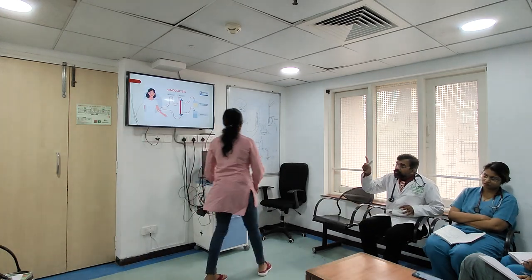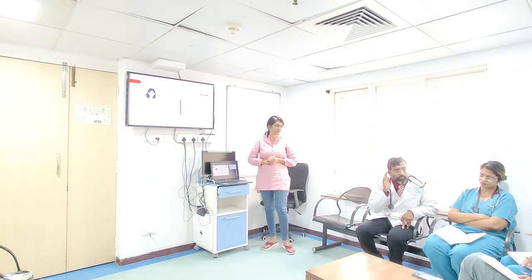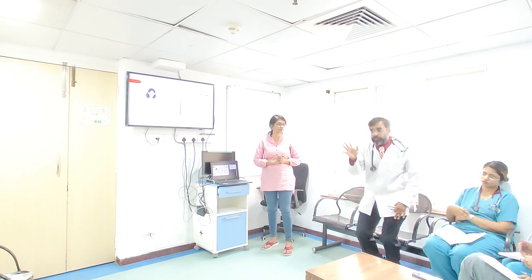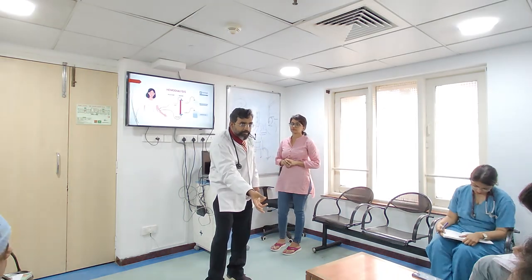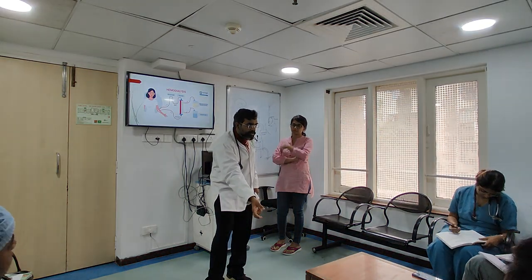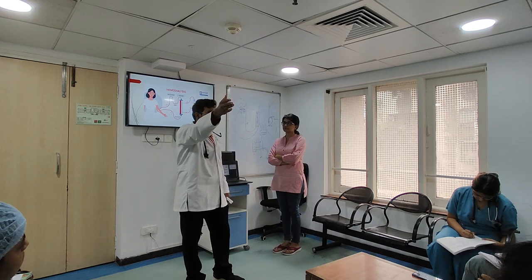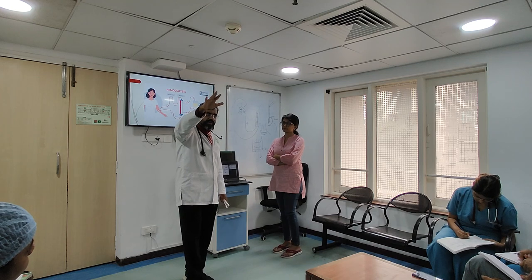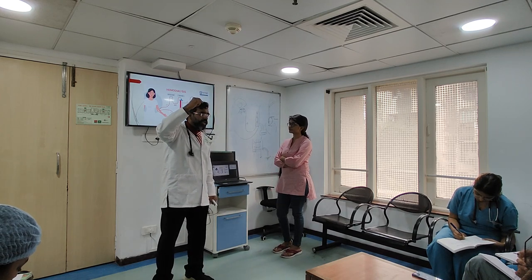You've understood this, right? So in intermittent hemodialysis, the water is coming from something called an RO plant. When you have intermittent hemodialysis happening over here, the water is coming from a pipe, and that pipe has an RO plant outside our ICU. That plant is maintained at a very high sterility level. In fact, there are weekly cultures taken from there.